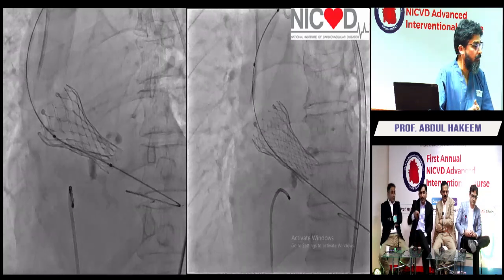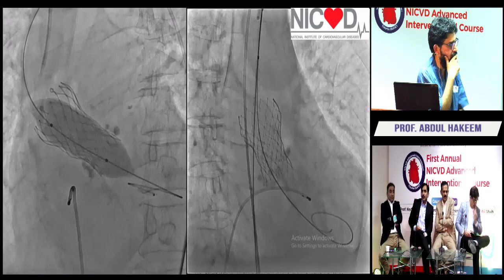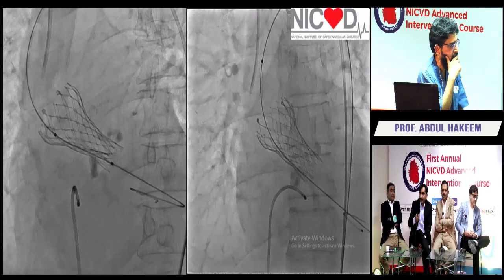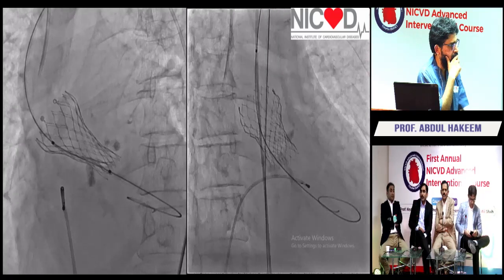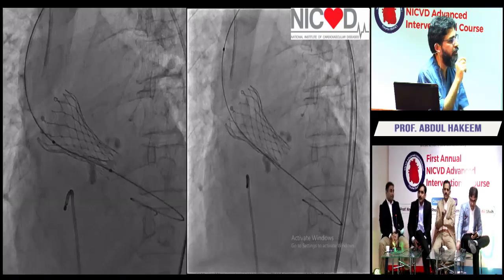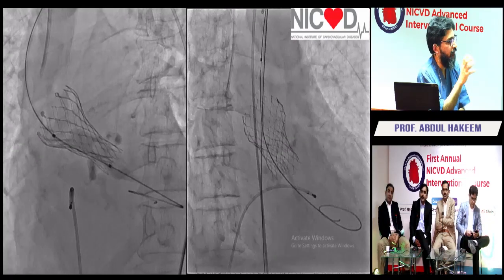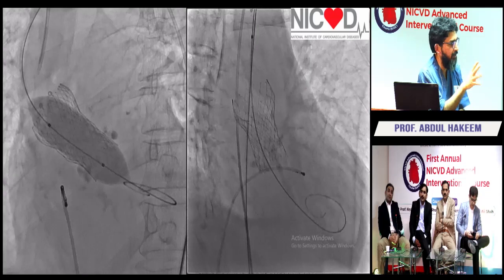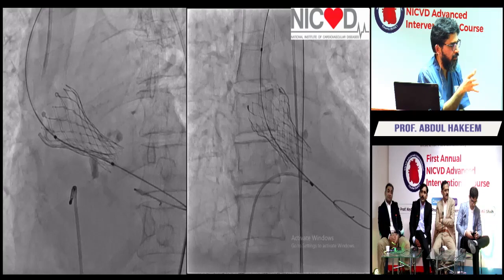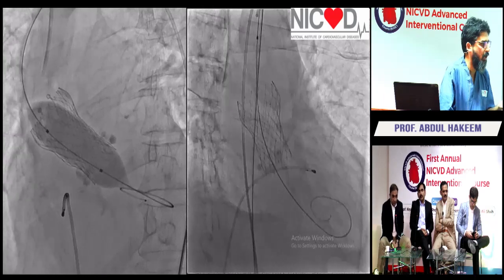At the end of deflation, you have to pull the balloon, just some traction to the balloon. While inflation, you have to give some tension toward the LV, and during deflation, you have to just pull it backward. The technique you are saying. No. You have to have gentle forward tension on the balloon. You have to push it, because the problem is the LV has now recovered and it spits out the balloon, right? It spits the balloon out because this LV, even with its dysfunction, is able to mount pressures of 300.